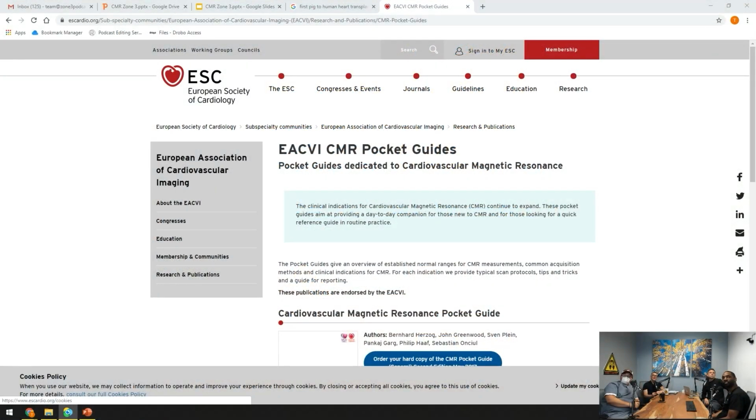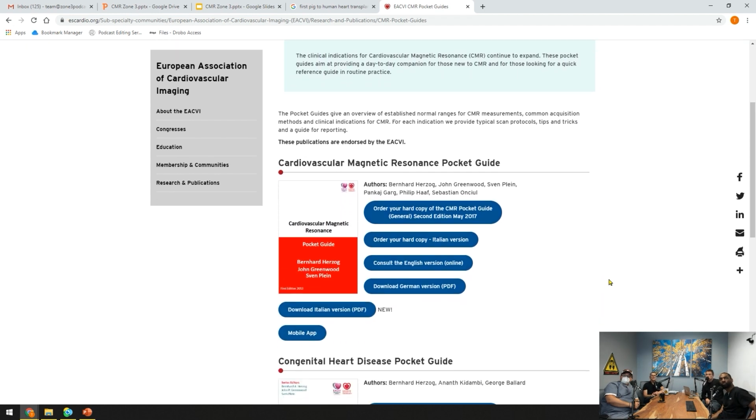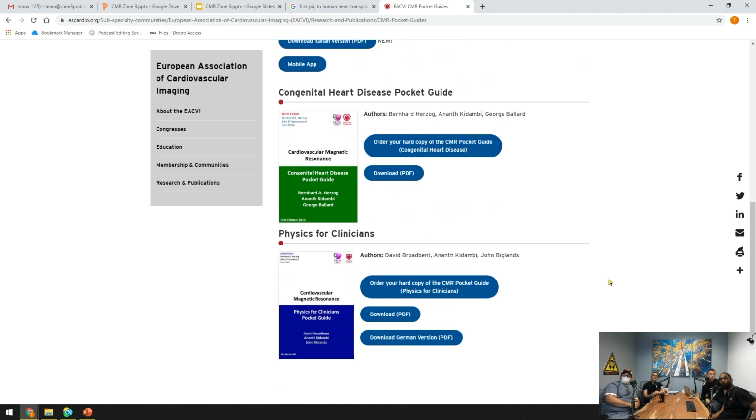That's right. One tool that I found really useful, certainly from the cardiology standpoint, is that the European Society of Cardiology has a nice app called CMR Guide. David, you could probably pull that up real quick. It's very well made, you can download it, and it offers a lot of information on the organization of an exam, the scan planes, some of the indications, and it provides very nice video content and examples of some of the sequences used. If you're interested in that, I would definitely check it out. They also have a calculator that comes with it that can help you quantify ventricular mass.